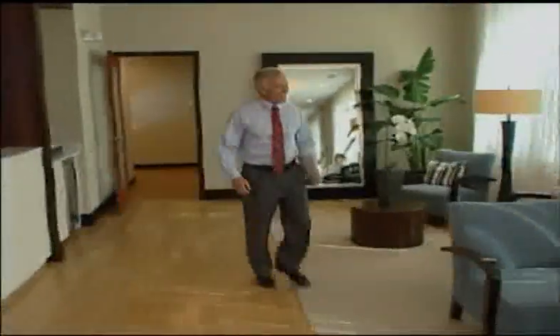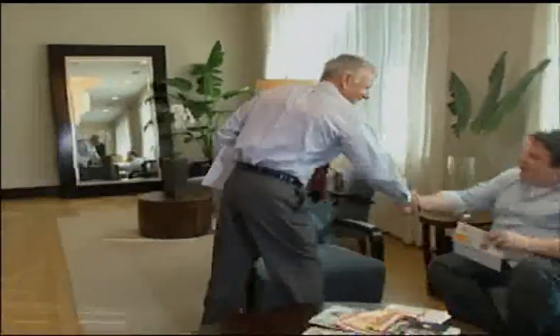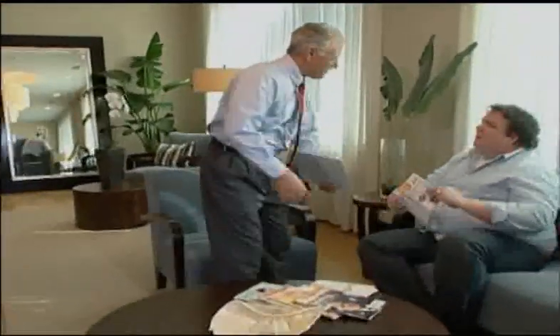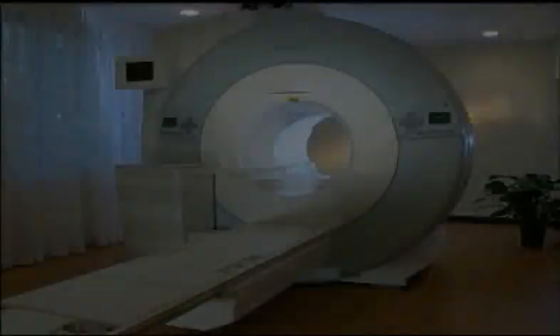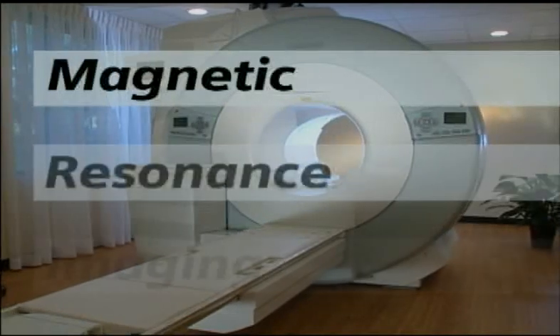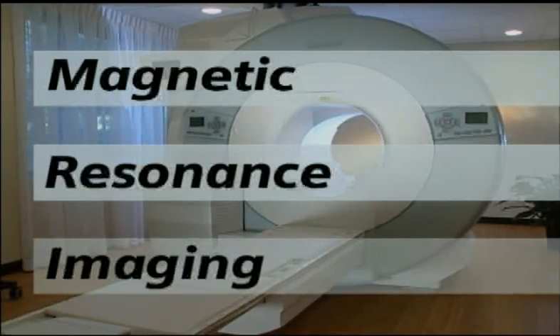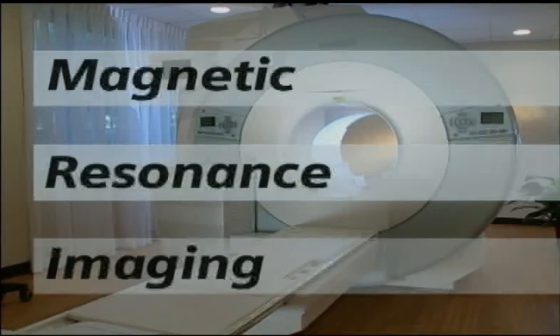Welcome to this MRI patient education videotape. Your physician has ordered an MRI for your medical condition. What is MRI? MRI stands for Magnetic Resonance Imaging, and for the next few minutes, we'll discuss the MRI examination.